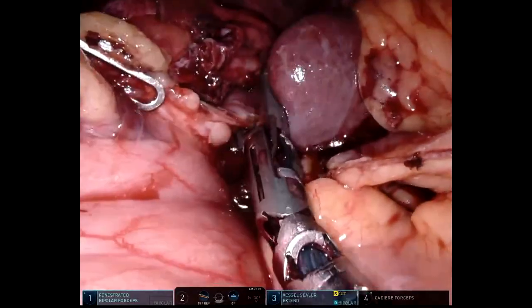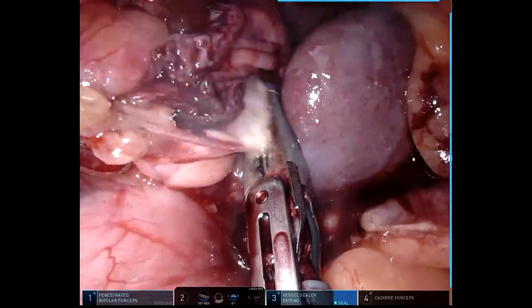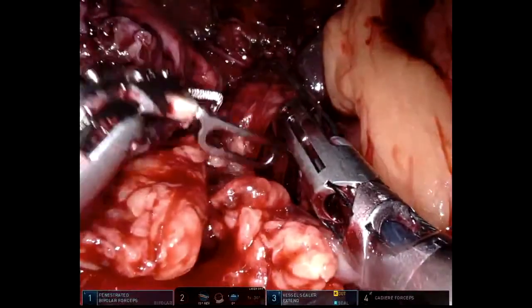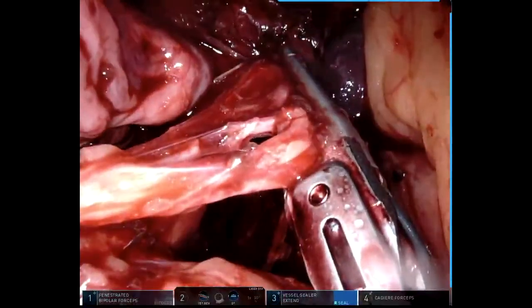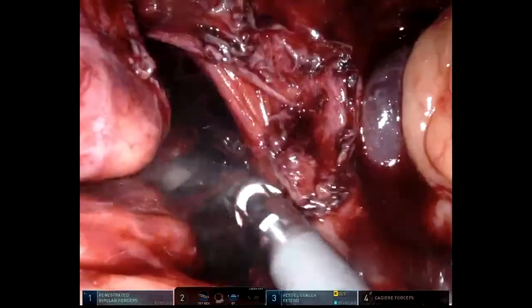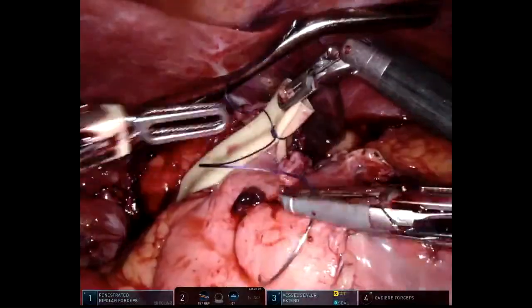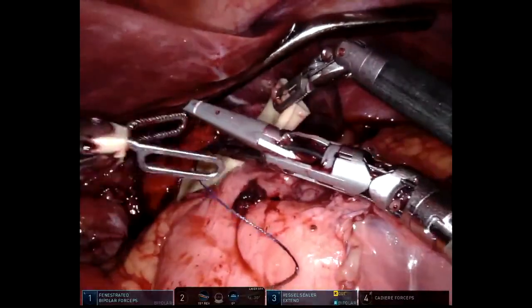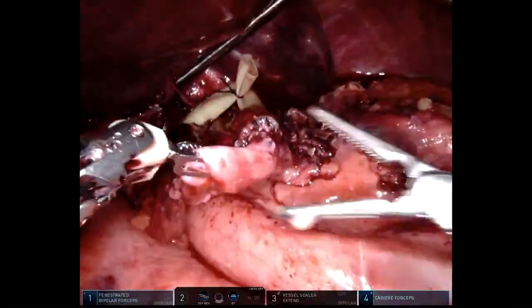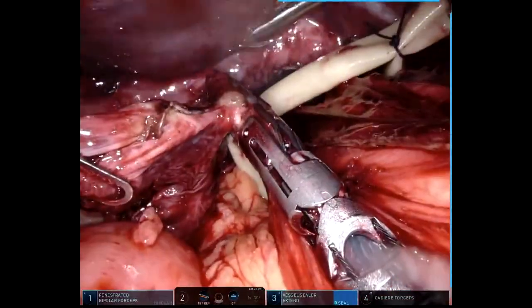Once again, the goal is to visualize the left crus and eventually to get to the confluence of the left and right crus. The penrose is retrieved and a suture is placed in order to keep it in position. We can now start giving ourselves appropriate traction to completely mobilize the esophagus. You can see the large hernia sac as well as the vagus nerve.